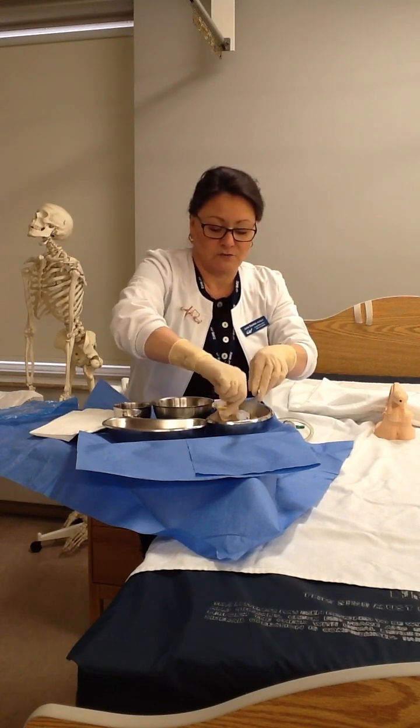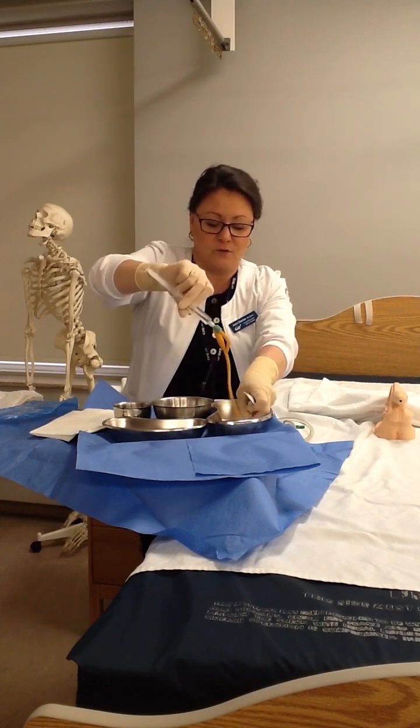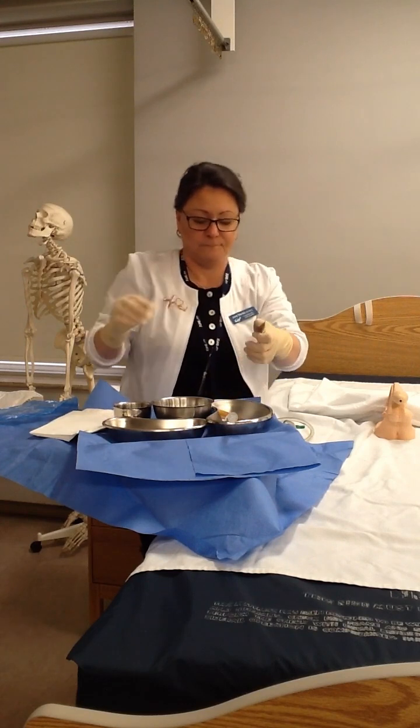Let it fall into the basin and it'll coil back, and then let your syringe, you want it to not bounce around on you. Okay, so play with that until you have it the way you want it. Don't let it bounce out on you. There you go. It's set up for me.